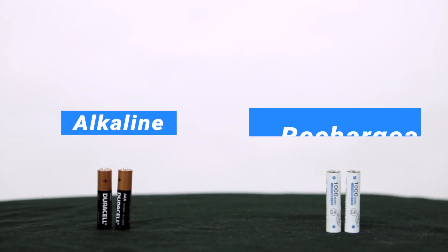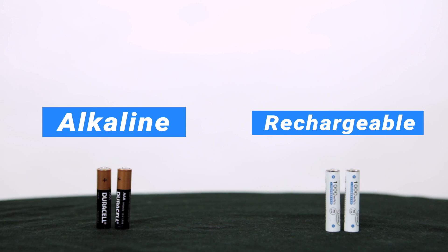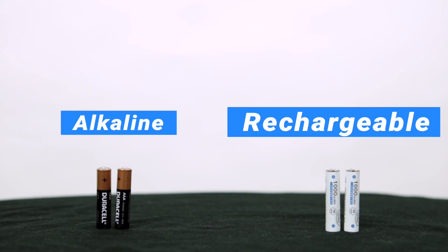You have the option of either using standard alkaline batteries or the rechargeable batteries that we include in the case with your device. The type of battery you choose depends on how much you use your device. Alkaline batteries last longer but could cost more to replace. Rechargeable batteries do not last as long but cost less money in the long run. We recommend using alkaline batteries if you use your device infrequently.